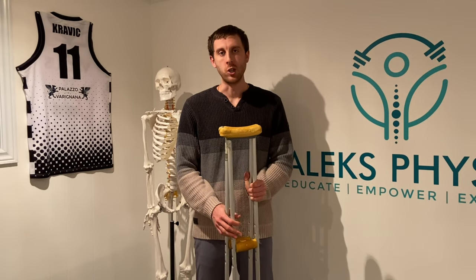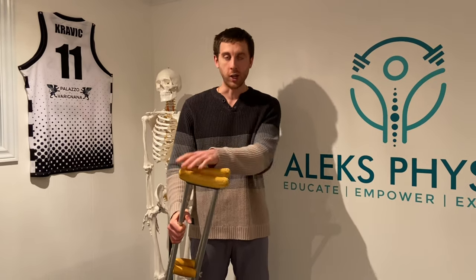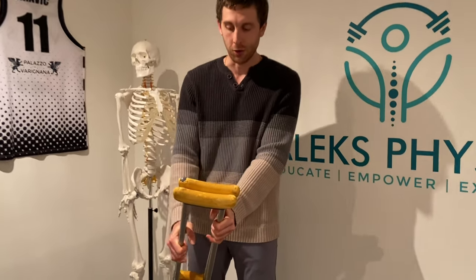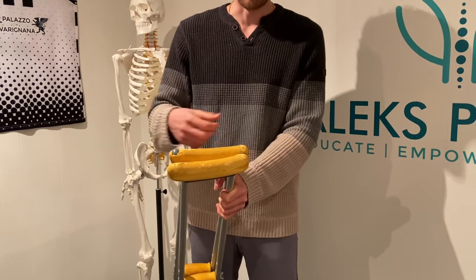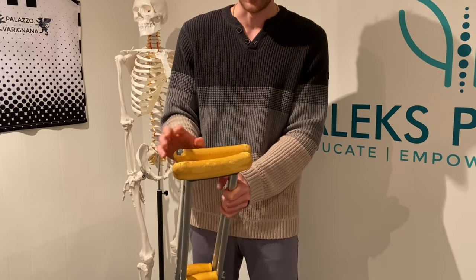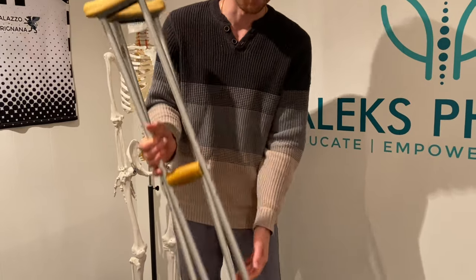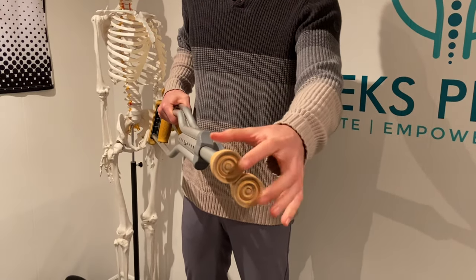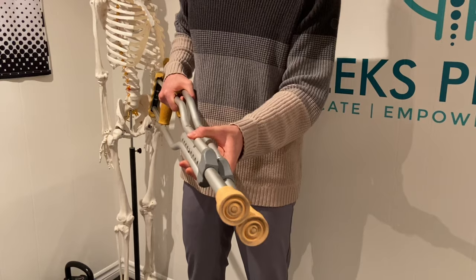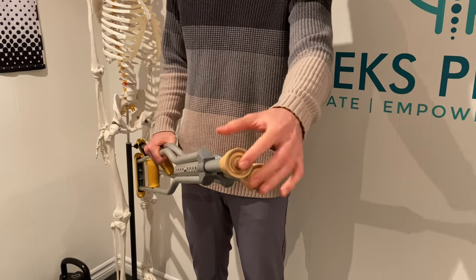If you're getting crutches that have been in the closet and haven't been used in a while, always check their condition. Look at the top of the crutch to make sure there's sufficient padding — if not, put some softer material on there, as your armpits can get sore over longer use. Also check the rubber grips on the bottom of the crutch. This is super important because on slippery surfaces there's a risk for falls, so you always want to make sure you've got a good grip.